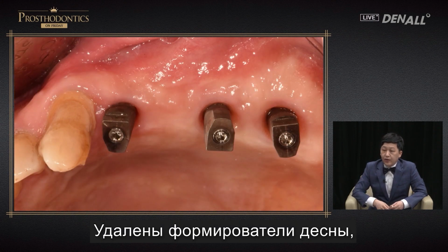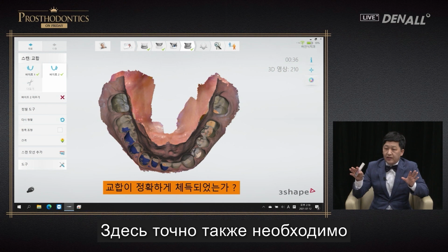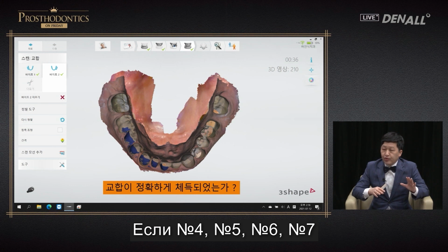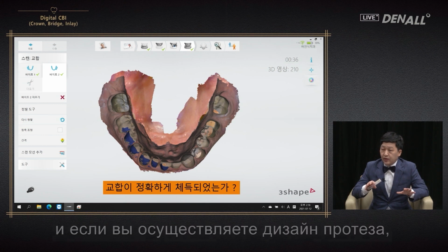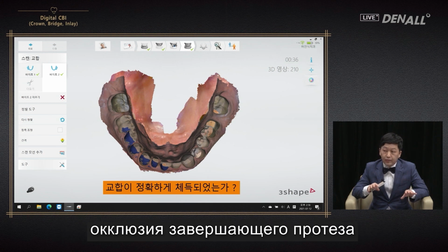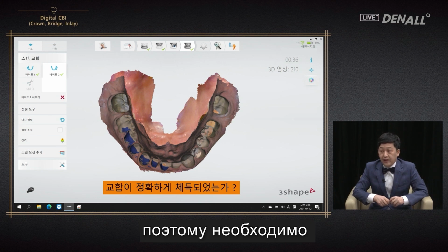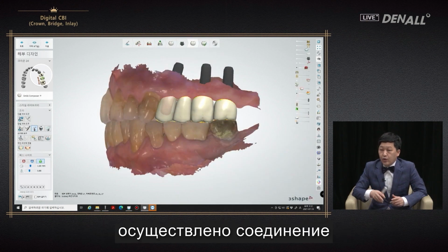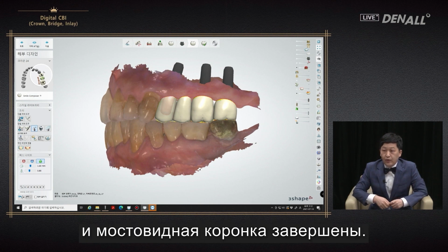Healing abutments were removed, scan body was connected, and scanning was done. This is the same. You need to check whether occlusion has been registered nicely. If numbers 4, 5, 6, and 7 are missing on one side, at times occlusion is tilted. And if you make prosthesis design, the occlusion of final prosthesis can be too high or too low, so you need to pay special attention whether occlusion has been registered nicely. As shown, check whether merging is done accurately. And finally, abutment and crown bridge has been completed.